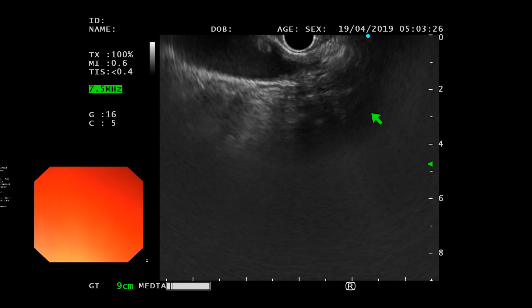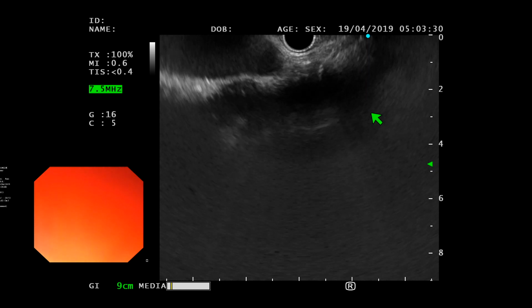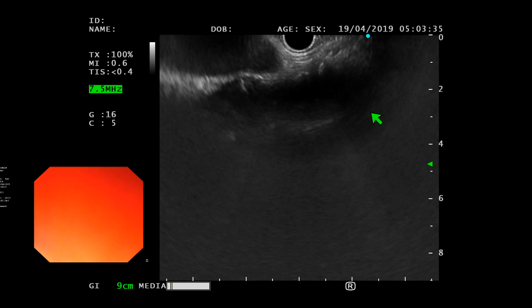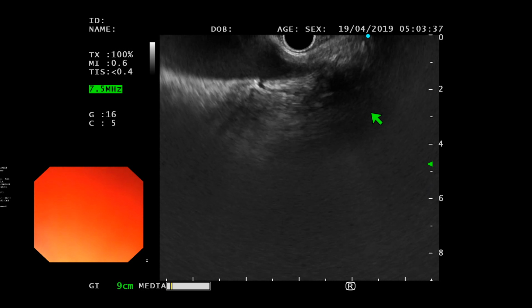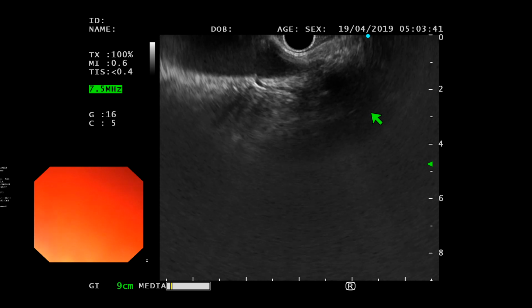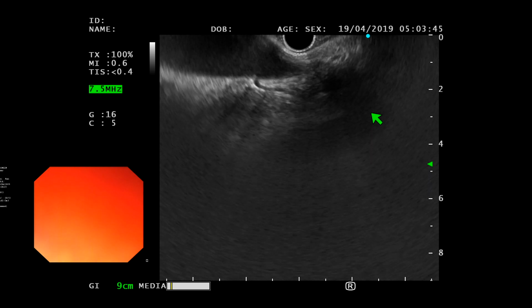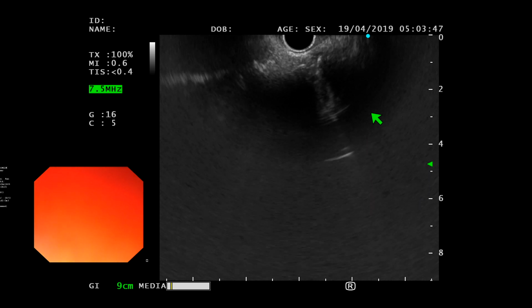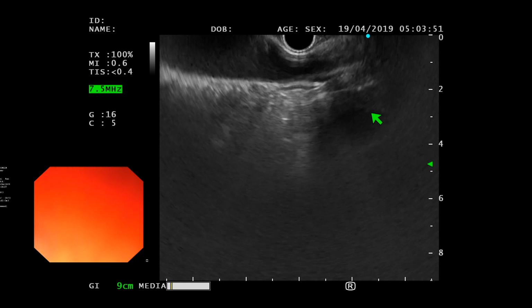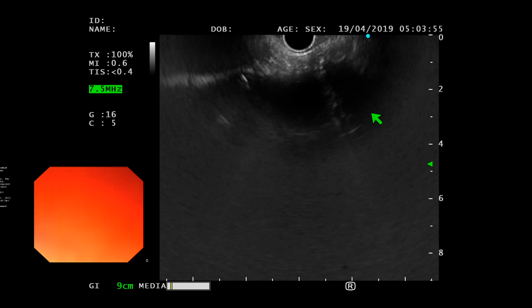You're doing fine. Keeping aorta in the picture. So at this point your brain should learn, do I go right, do I go left, a small movement, and at this point your fingertips need to have a connection with your brain. This is hand-eye dexterity, right? So when you do this 4 or 5 times, your brain with your fingertips will learn the image and the hand movements to go through. But you're doing absolutely brilliant.